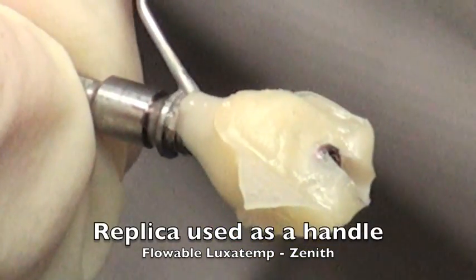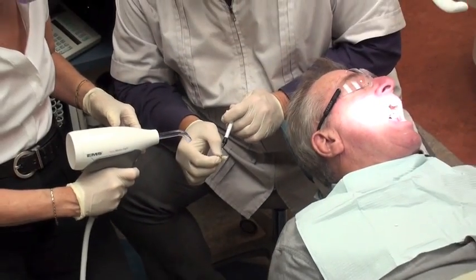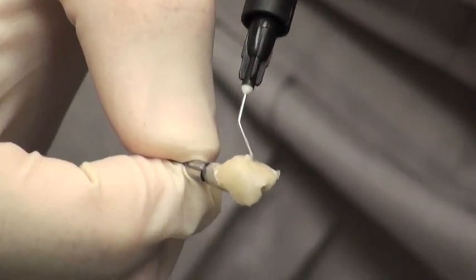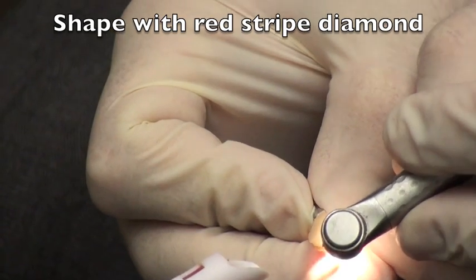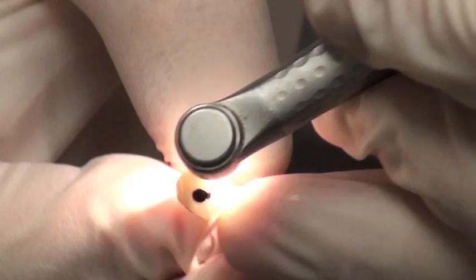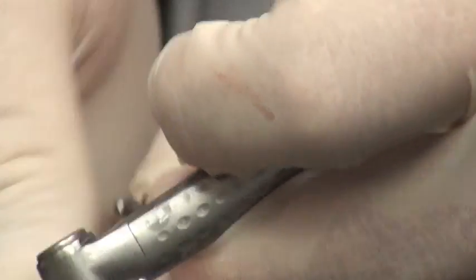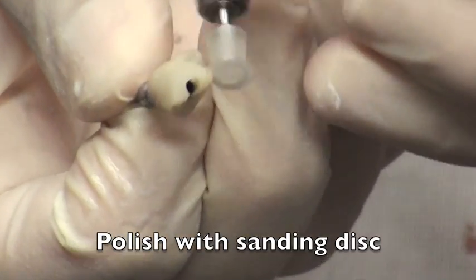We start to build up some flowable resin using Luxatemp flowable resin from Zenith, building it up and light-curing it — creating an emergence profile. You want to create an emergence profile that is very similar to the shape of the root anatomy, so that it is going to support the papilla and make this a nice result for the patient. We're able to build this down to the top of the cylinder, which is just over the hex. There is a margin area so you can see where you want to build this down. The beauty of this is it is all done outside of the mouth. As we smooth this down, we shape it and get an idea for what we want to accomplish with the crown fitting up inside to support the papilla, creating the emergence from the actual implant out to the full anatomy.